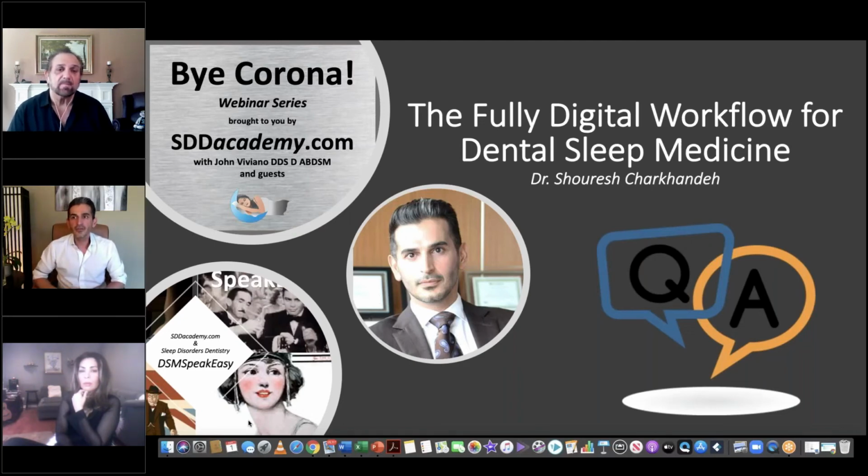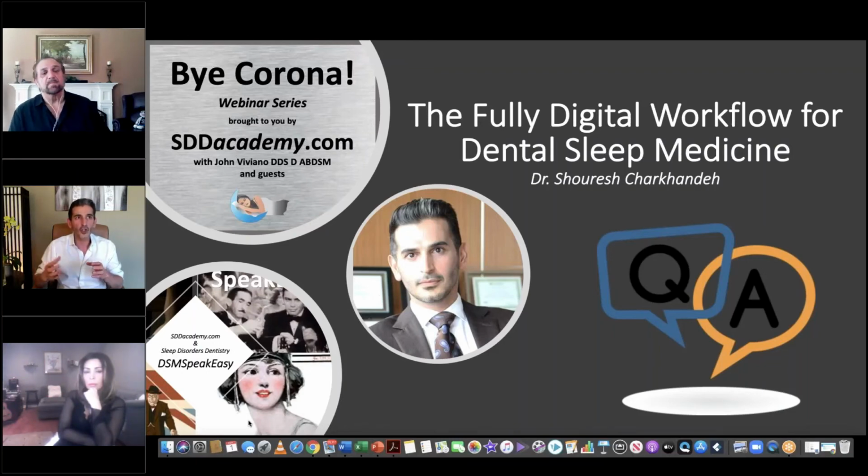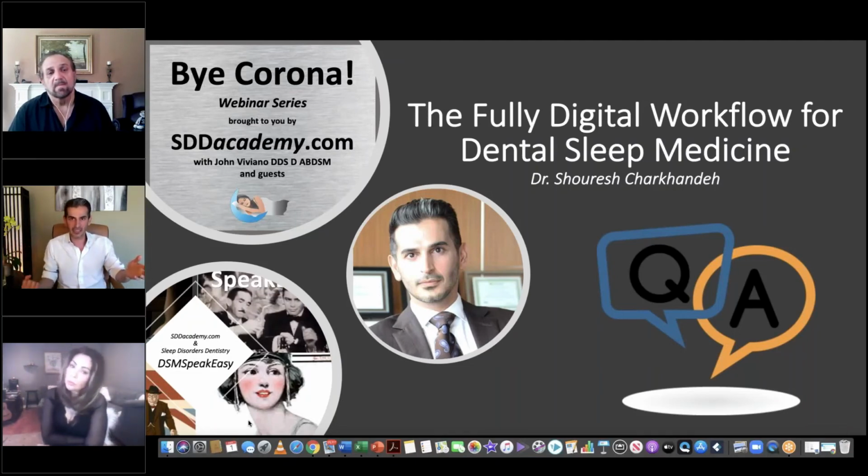But clinically, to me, vertical, and again, the research, I don't need to repeat this, the research on vertical seems to be all over the place. The few good studies that I do know of in terms of just how it affects the response to oral appliance therapy seem to say anything between 4 to 8 millimeters seems to be okay. If you go more than that, 8 or 10 millimeters, now you could actually compromise the airway as well. So the effect of vertical overall, systematically over all patients, doesn't seem to be there as of today.